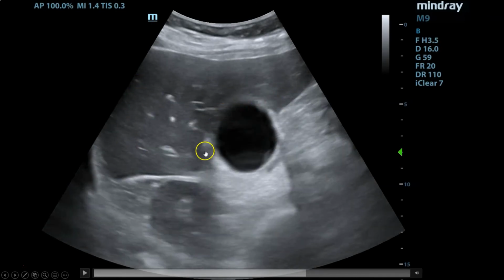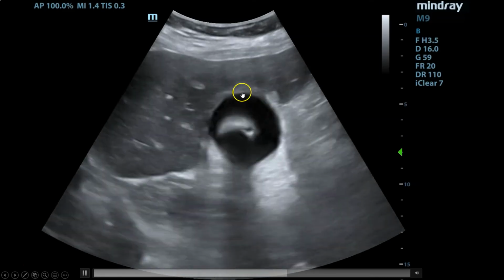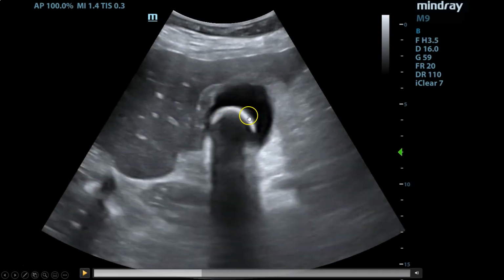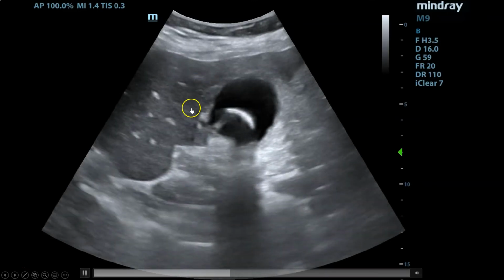And now you're seeing right here, this looks like the gallbladder for sure, but then you see this bright, huge hyperechoic thing that starts up right here. So hyperechoic spot here, and then you can see that it shadows like crazy away from you. And that shadowing would argue that this is a gallbladder stone.